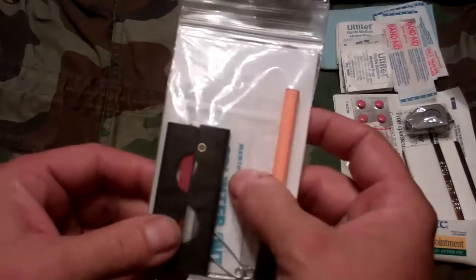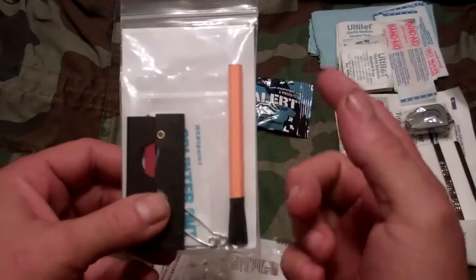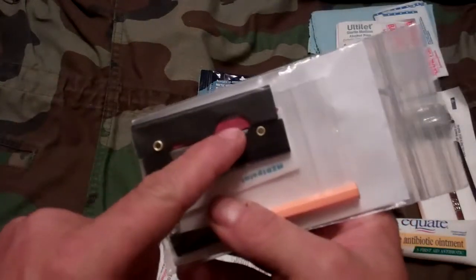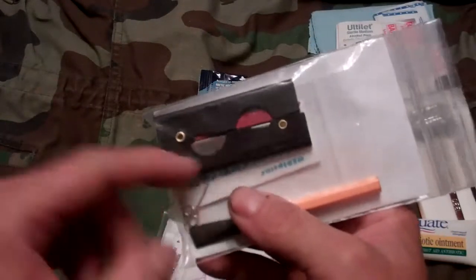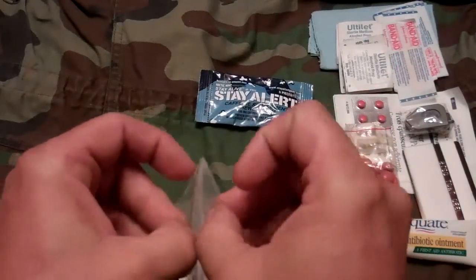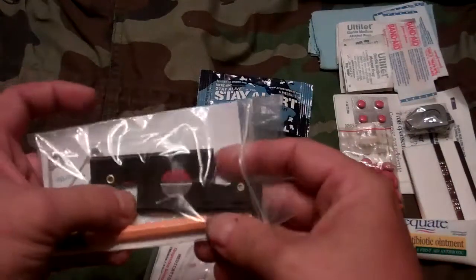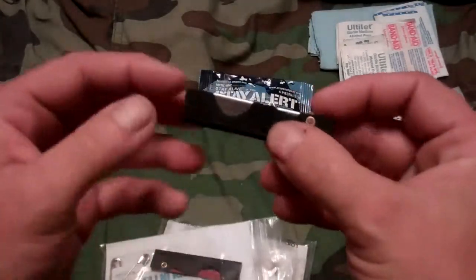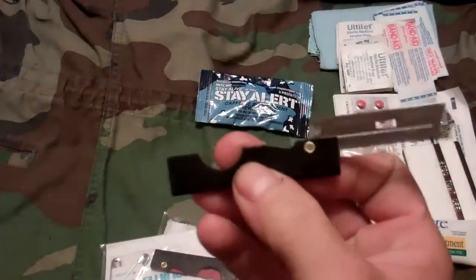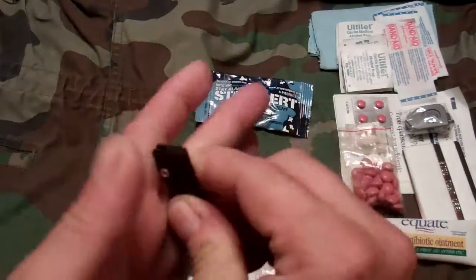The splinter outs, if you're not familiar with them, are a single serving kit, if you will, for removing a splinter. And these two blades are pretty self-explanatory. You've got a small hacksaw blade and a razor blade that folds up into a small package. I'm going to try and make this quick so I don't go in too deep, but we'll just take a little peek. Just imagine the other one is a hacksaw blade, and that's a razor. So I'll give you an idea what's in there.